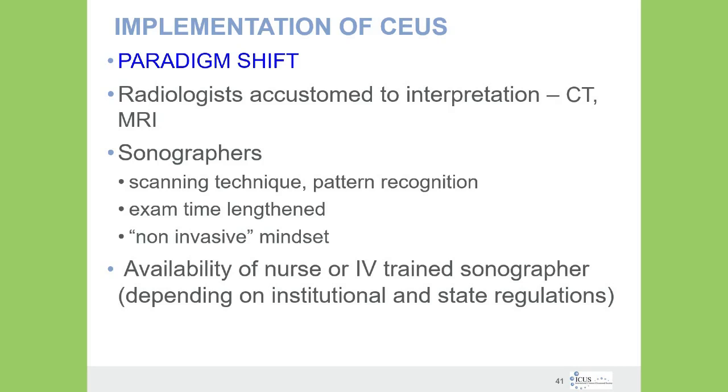So in certain states, sonographers cannot inject contrast. Therefore, we need either a nurse or a different imaging technologist, or in states in which the sonographers can inject contrast, and we have sonographers who are IV trained, we need someone to place the IV as well as to inject the contrast.